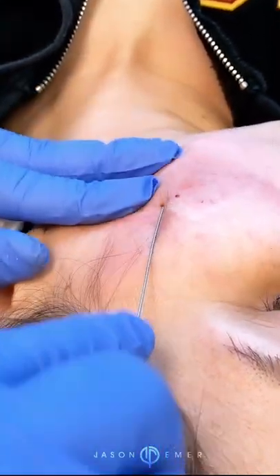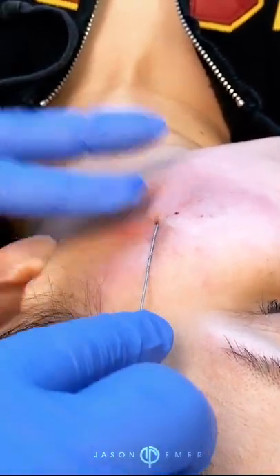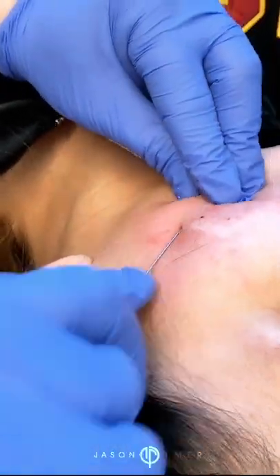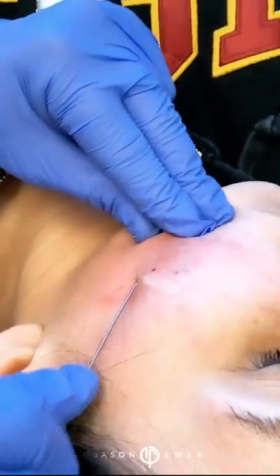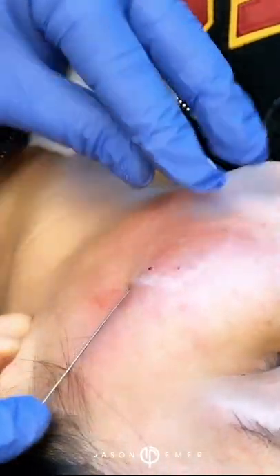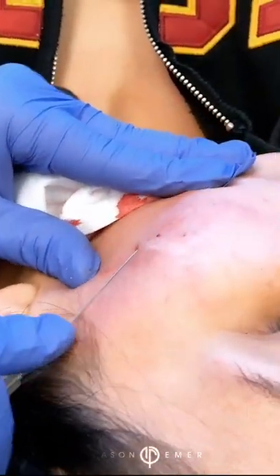So we've released this whole area, and I'm very, very meticulous. I go through over and over, making sure we get the best possible outcome. I'm also pinching the skin, making sure we're going into the dermis and not just the subcutaneous space — pinching to break apart any of those little scars that are harder to see. We can break them apart, going right up under the surface.